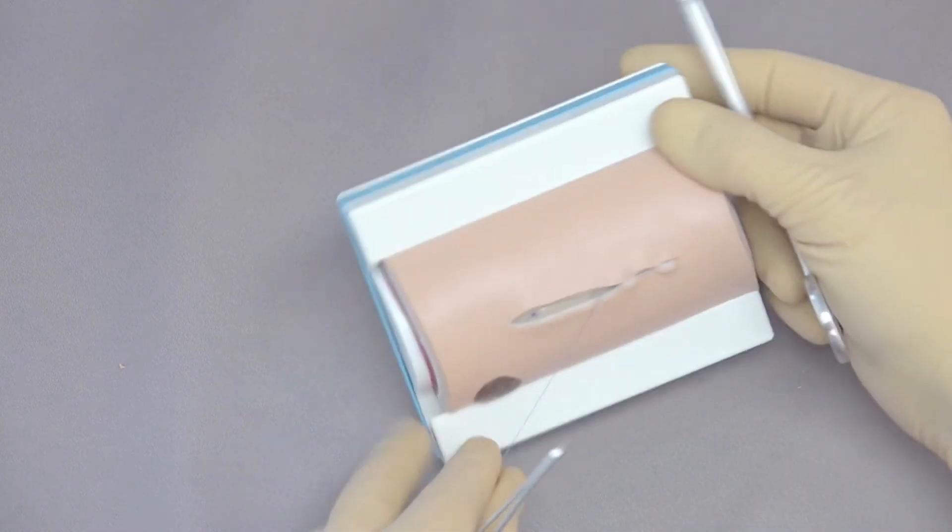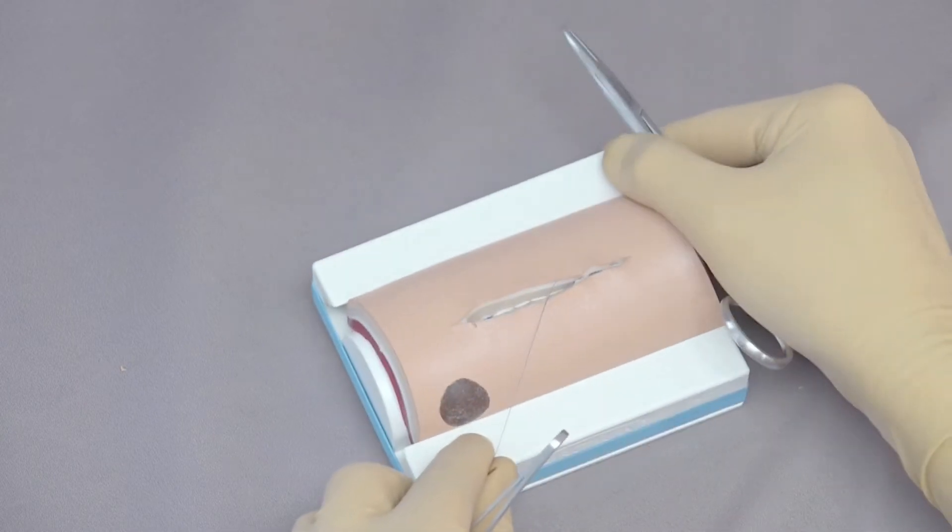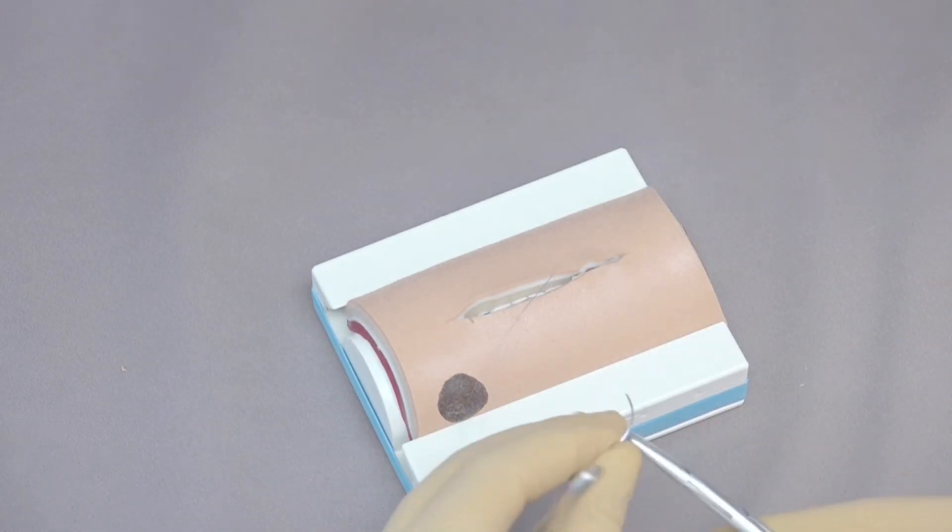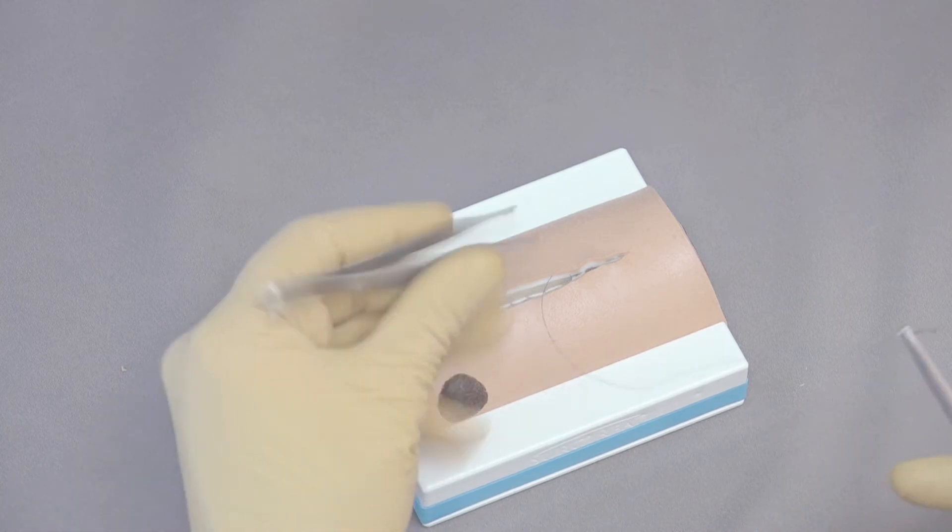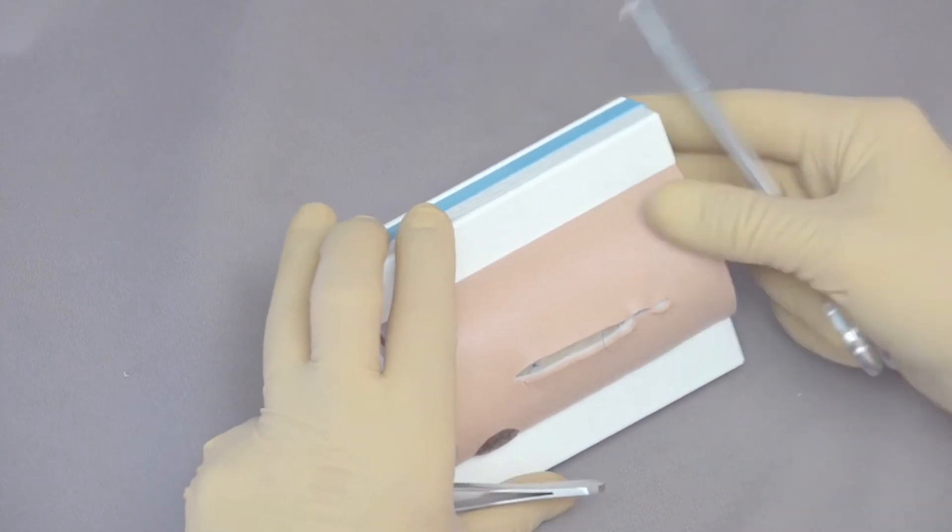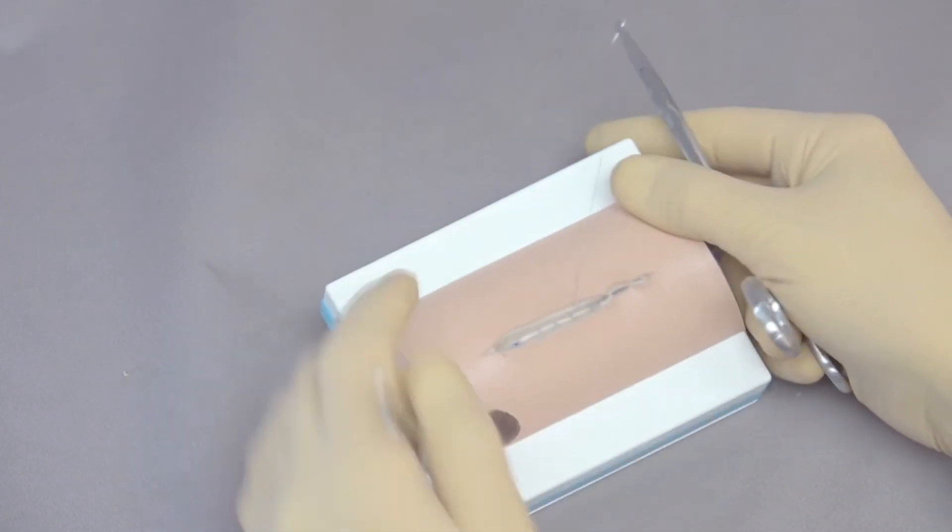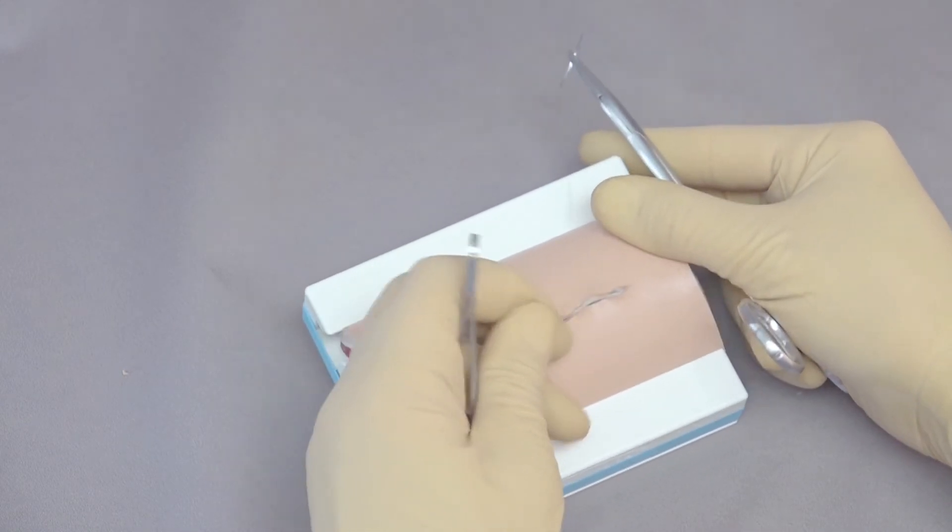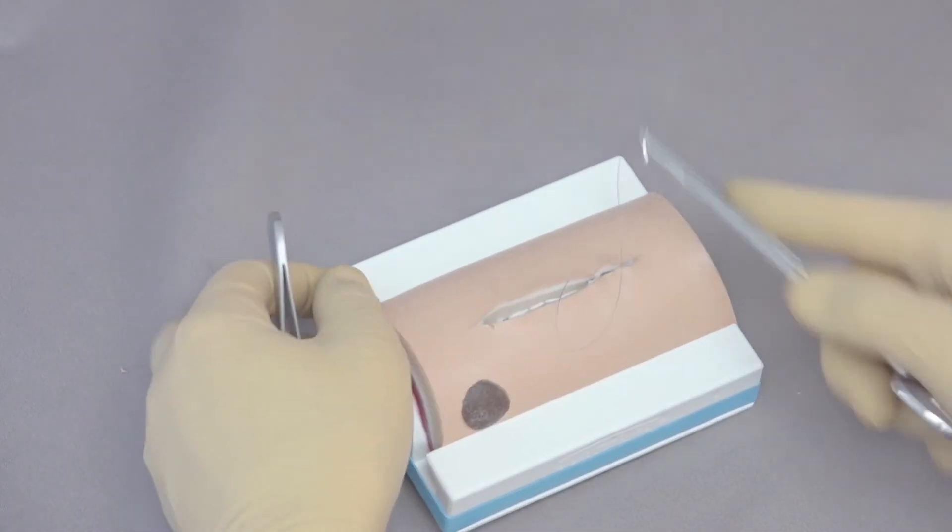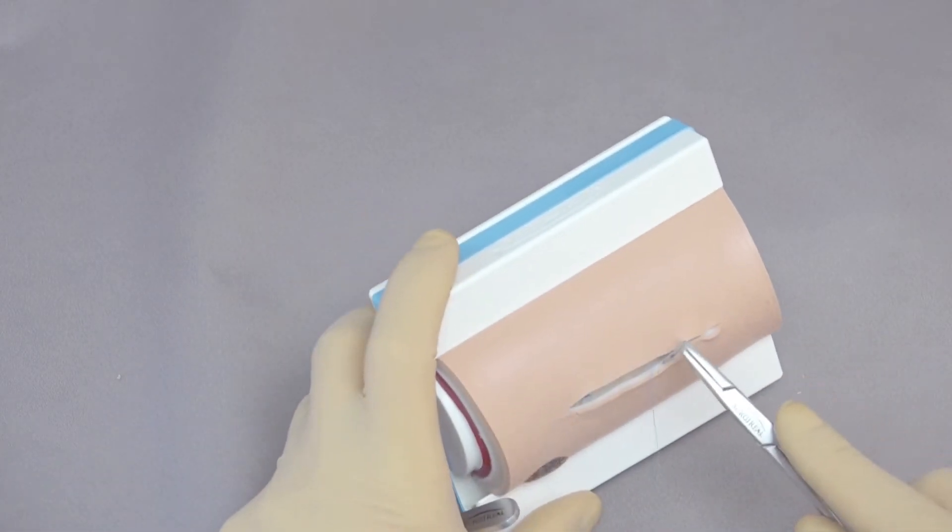So it's all part of my learning process as I'm suturing to see how those come together. And I have to make sure that the depth of my suture bite from superficial to deep is also even, because if I take it deep on one side, so for instance, you can see here that my suture bite was a little deeper in the dermis. So that raised that area up. And that's all part of this process. So we want to be learning as we are doing this procedure so that we can make sure that we do this well.